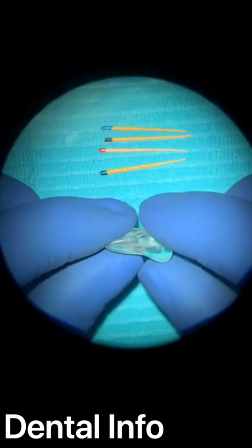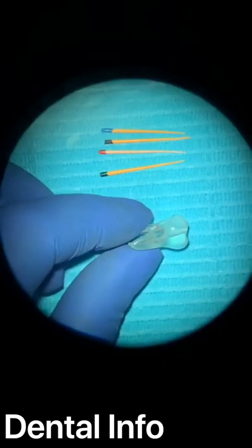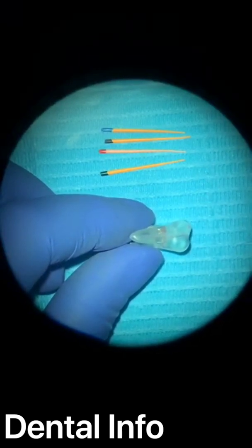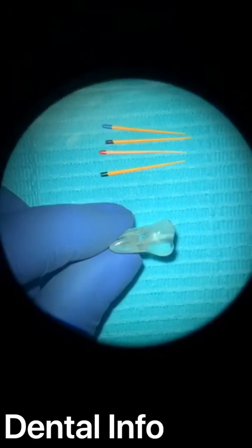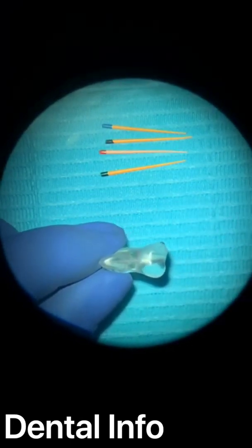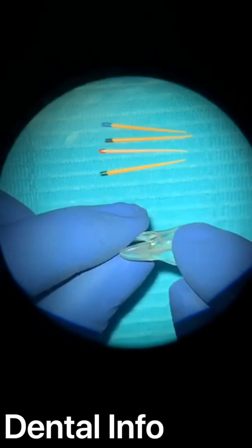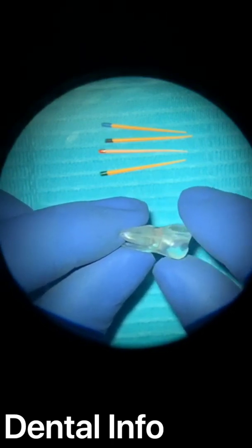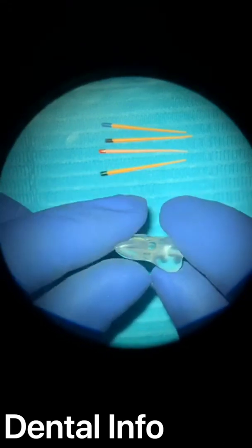Okay. So, I have this tooth, upper molar. We will work today in the palatal canal. The canal is prepared up to 25/06. Okay? So, the issues here, we will talk about warm vertical compaction, but before that, we have to talk about tugback, because a lot of people have a problem with tugback, and they always say, doctor, I put the cone and I checked with the x-ray, everything is okay. After obturation, after I finish everything, I'm taking x-ray and unfortunately I have overextended gutta-percha.